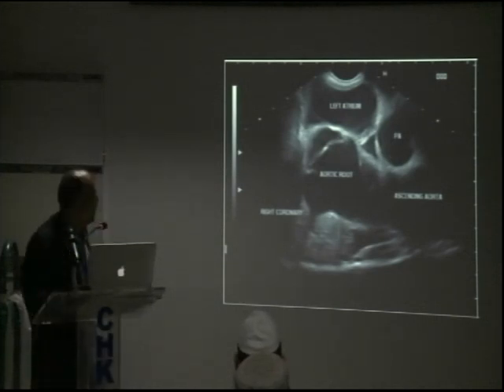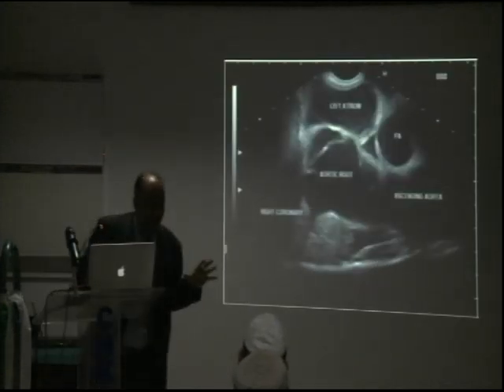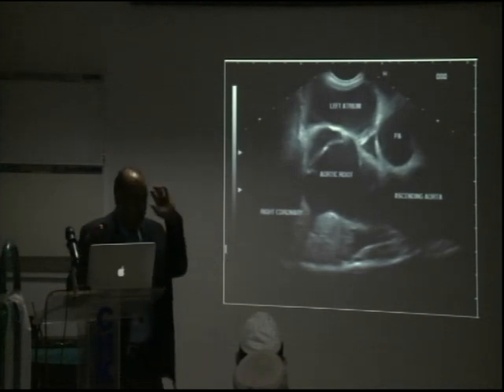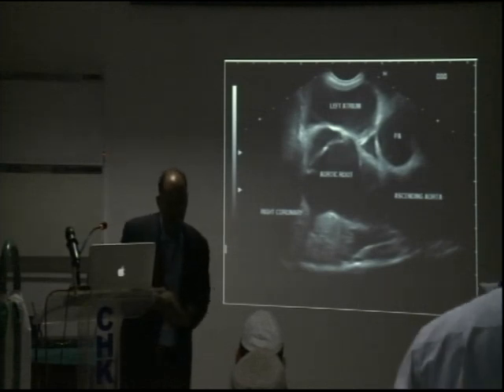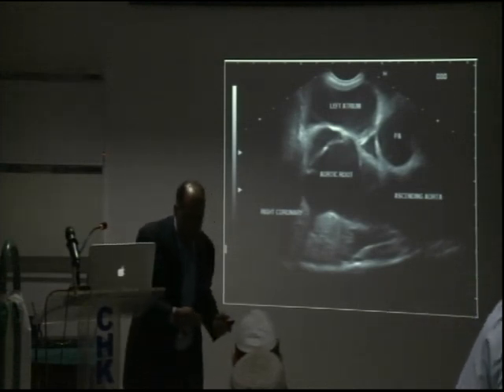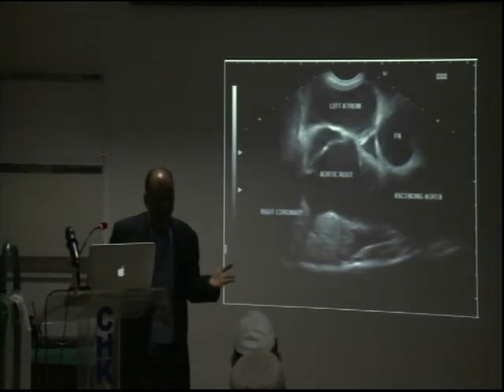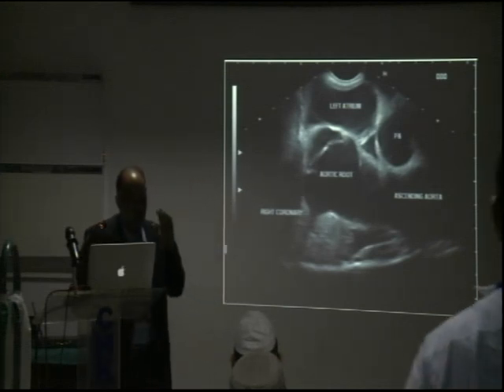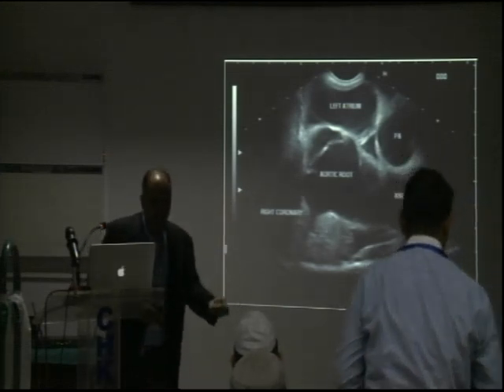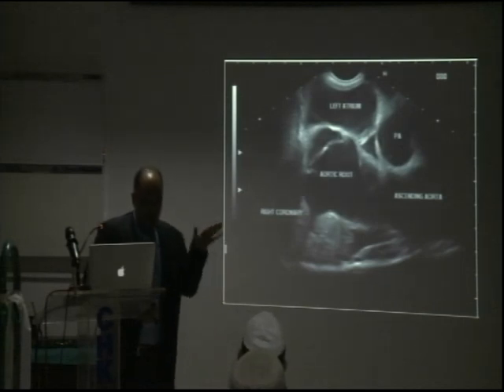And at what centimeters from the incisors? Don't go into that. Identify the structures. Once you're inside, you'll be saying 30 centimeters, 47. But if it's a taller guy or a shorter guy, it will be different, isn't it? Identify structures, get familiar with the structures, and do not get into where exactly it is. I'm just orienting you because if you get lost, you need to know what's happening with the scope and your knowledge.